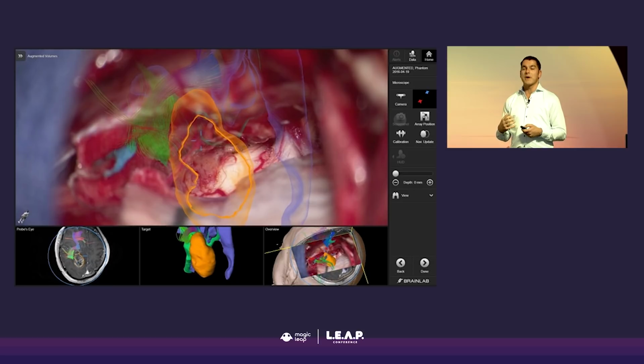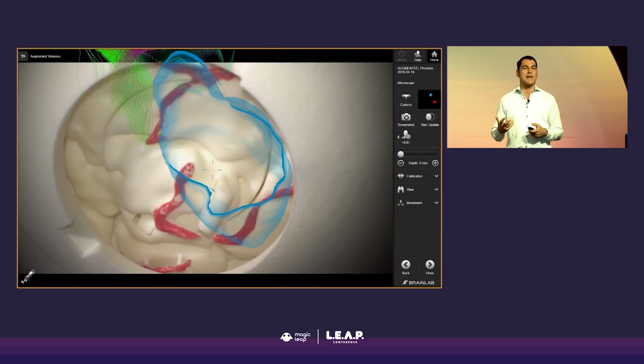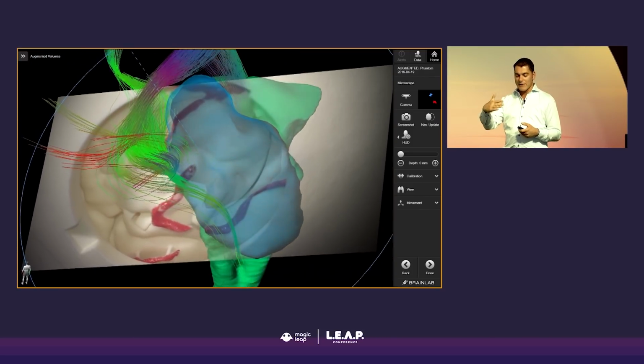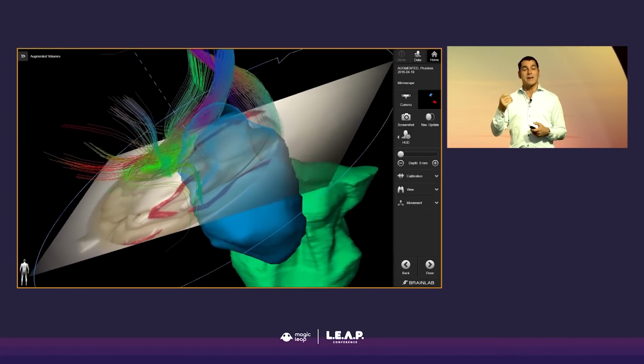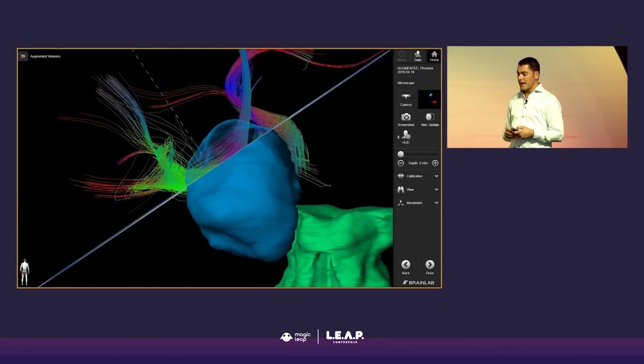And I want to show how we can digitally integrate that and the first application of mixed reality that is today in use in thousands of operating rooms and procedures every day. And the overlay shows the exact extent of the tumor deep below and the way all the other critical structures wrap around the tumor. So now, if we want to bring that to life, we can increase the spatial orientation by flipping that plane in 3D space, and you get a true impression of the extent of the tumor as it extends below that surface.